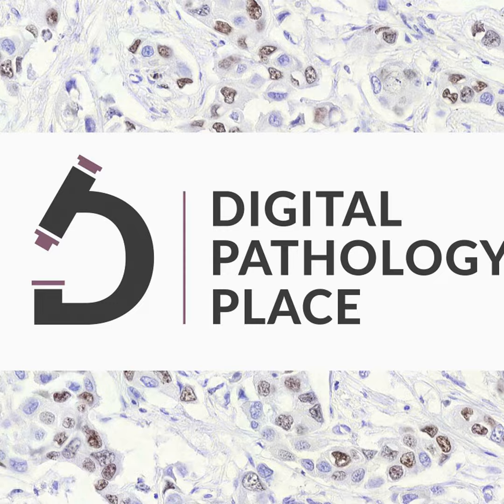We've been touching and mentioning the pixel pathway. So basically, when digital pathology first emerged, the pixel pathway, the path that pixels take from scanner to viewer to display, was typically maintained within systems from a single manufacturer, right? And now we're seeing systems cleared with components from different vendors.